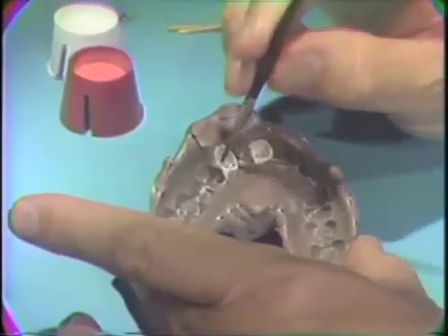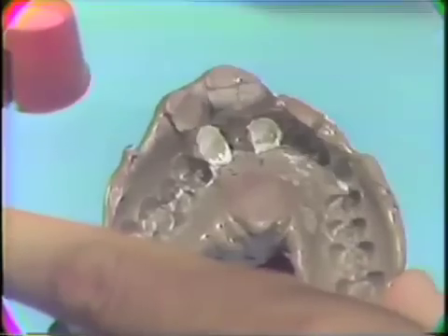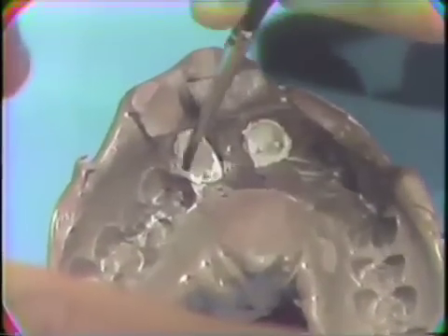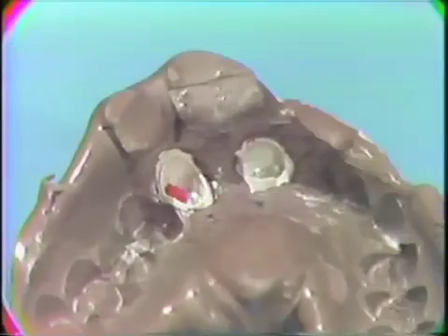Liquid monomer is very carefully flowed down into the innermost part of this silver shell. This will allow the Duralay to flow into these recesses very easily. It is important that the Duralay flow down into these recesses accurately without any bubbles.